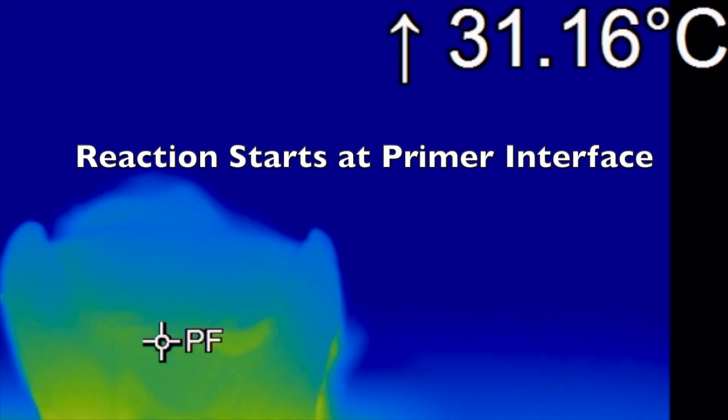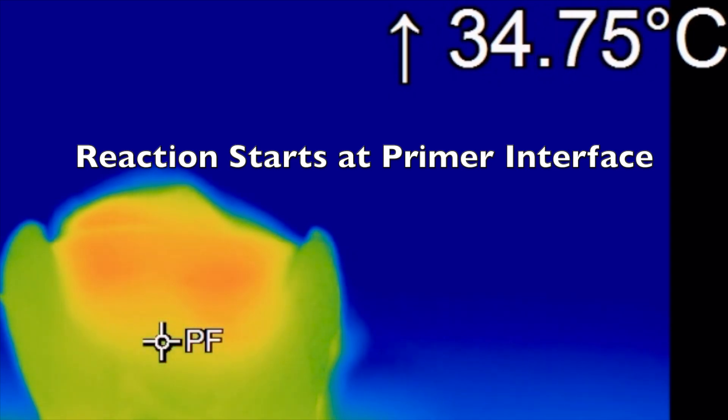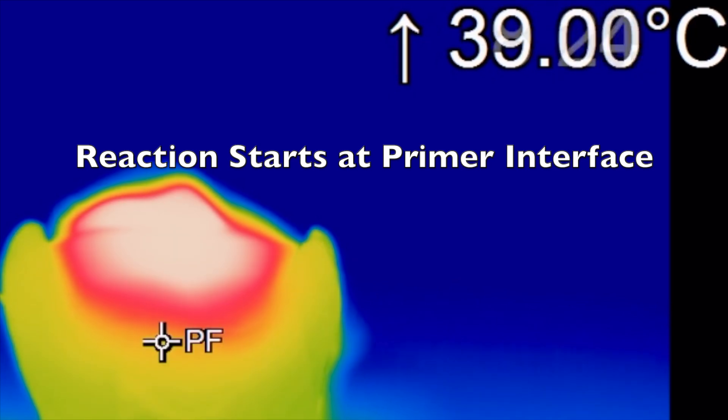In this slowed-down clip you can clearly see that the reaction is starting at the Stellar Primer composite interface and then spreads through the rest of the composite. So it does appear that the Stellar Primer initiates and then also accelerates the setting of the Stellar composite.